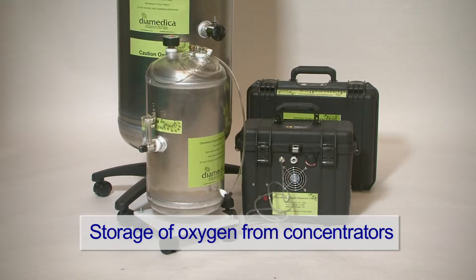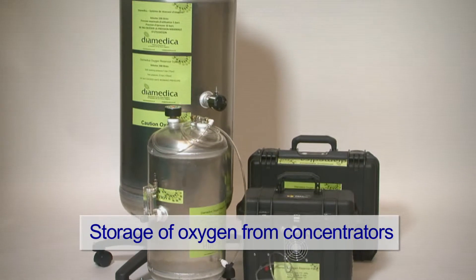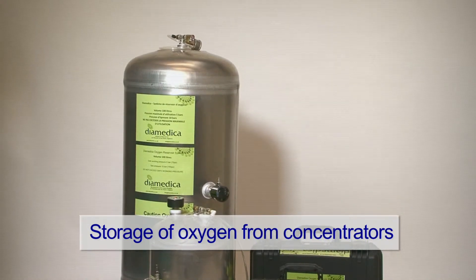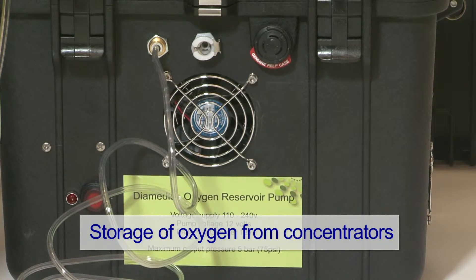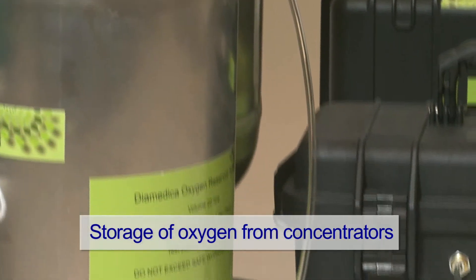The Diamedica Oxygen Reservoir System will take oxygen from an oxygen concentrator and fill either a 20 litre or a 100 litre reserve tank to a pressure of 5 atmospheres or 75 psi, giving 100 or 500 litres of usable oxygen. Multiple tanks can be supplied.